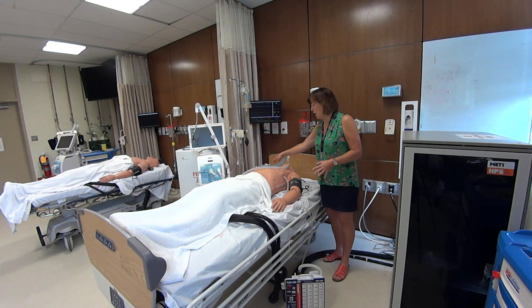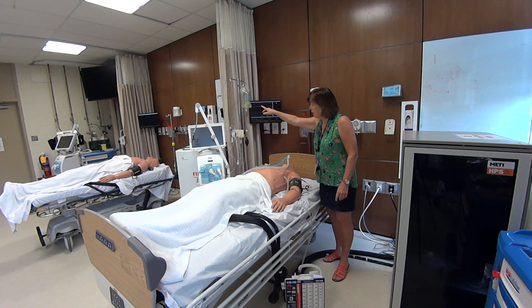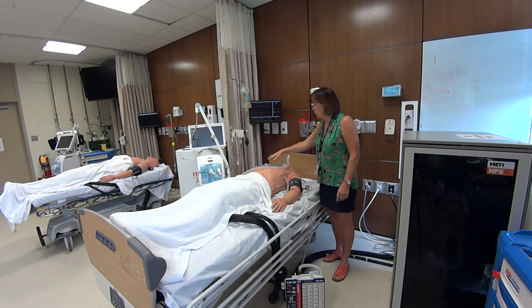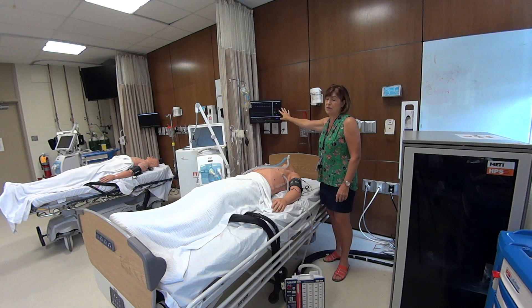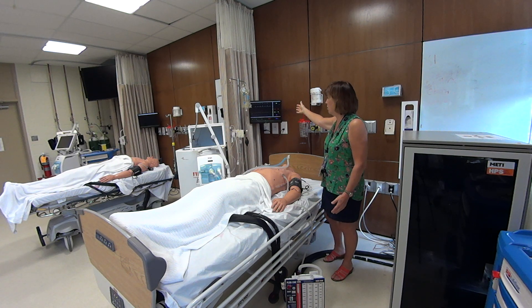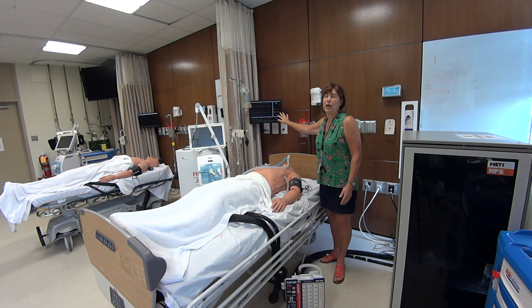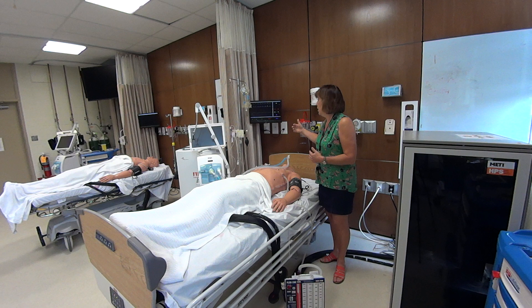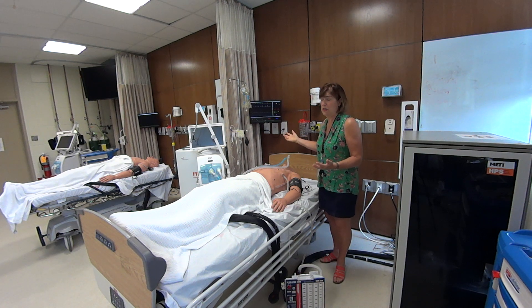The second thing you're going to see is lines coming here. This IV pole has a number of different things attached to it — a bag with some medications that might be running down, and some of these would be attached to the monitor. The monitor is showing you criteria for the patient: the top one would be the heart rate, next would be blood pressure, and you would often see a pressure area — another level of pressure being measured at the level of the heart. You will also quite often see the pulse oximetry, or the level of oxygen the patient has.